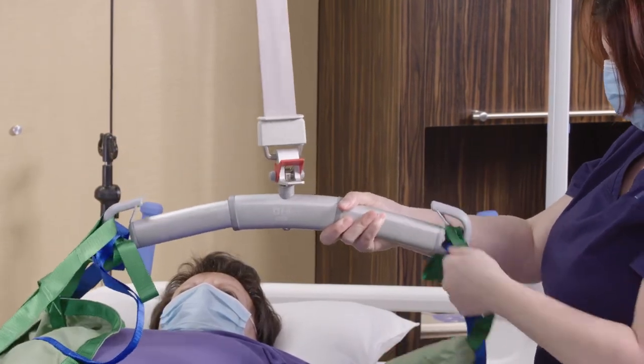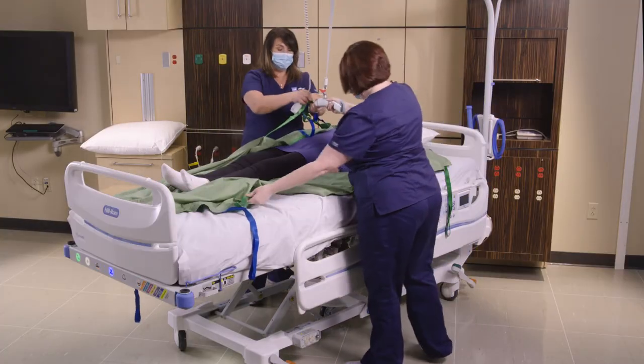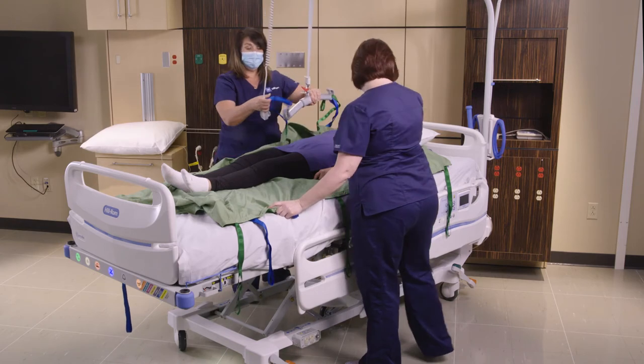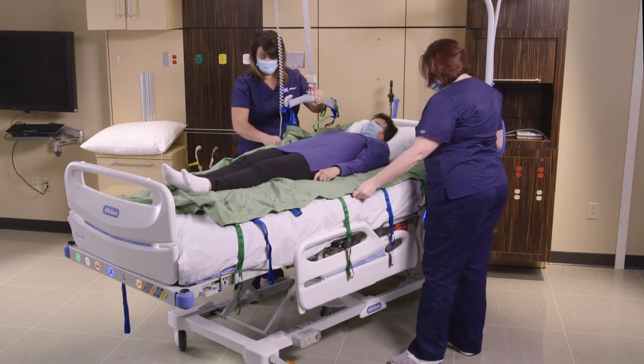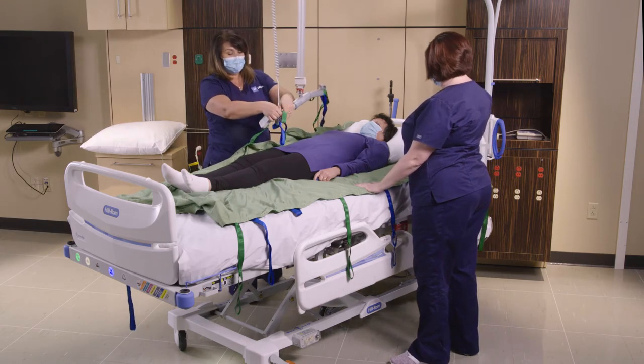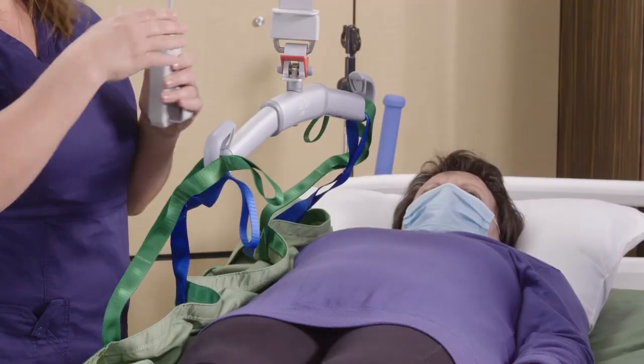I'm going to go ahead and straighten this out. While my partner does that, I'm going to disconnect the bottom two straps, then turn the sling bar and reconnect the straps. Again, I'm going to use the middle loop strap and connect it, and then when we're ready we're going to raise the patient up.